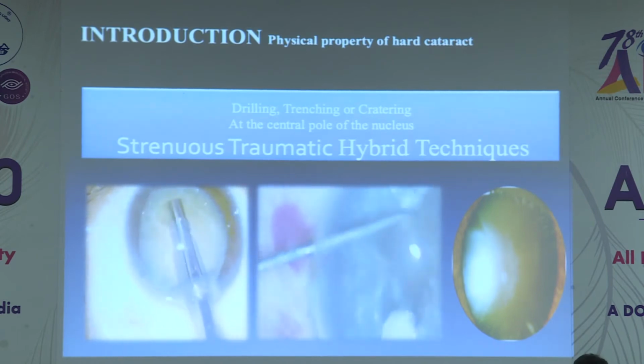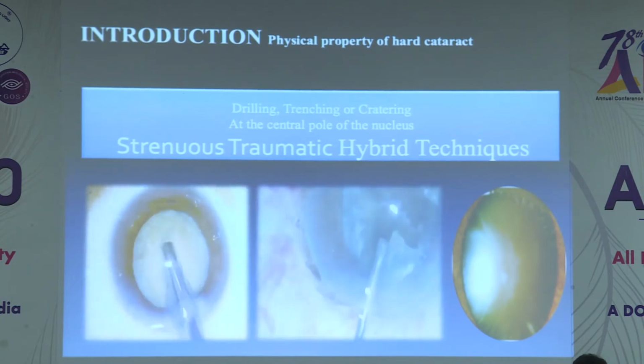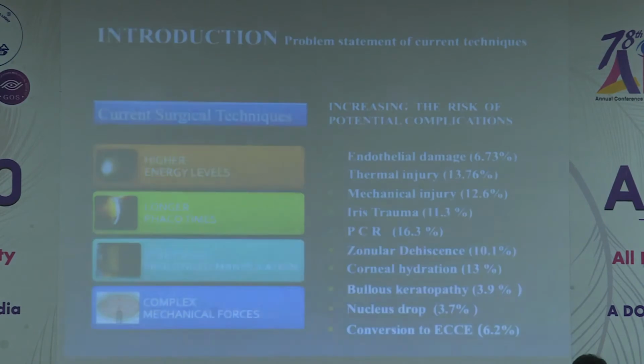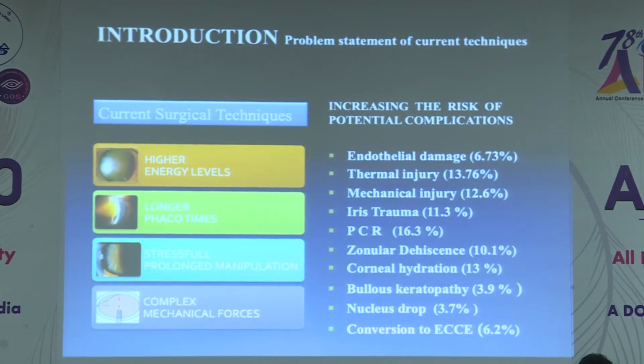You have to go in for multiple strokes on the nucleus. With these strokes, you are generating too much phaco energy and heat energy within the capsular bag and the anterior chamber, which could hit the endothelium and the posterior capsule also. That is the reason many times you land up with corneal endothelial damage. Thermal injury is very common, you must have seen thermal injuries and corneal burns, mechanical injury to the posterior capsule, and many times iris trauma, PCR, and so many other complications. Why do all these complications happen? Basically because you are tackling a very hard cataract with a very hard and thick nucleus, trying to divide it, and using too much phaco force and energy to do so.